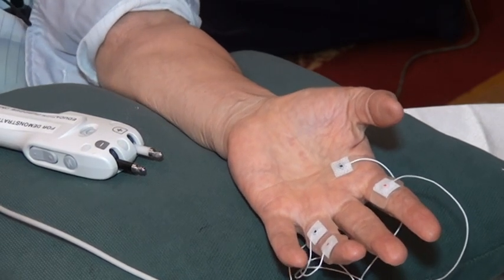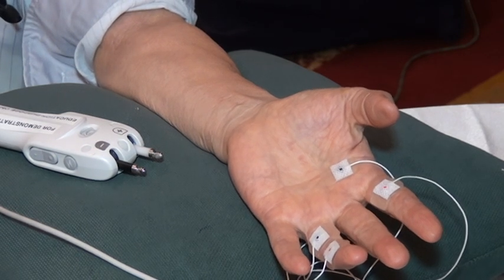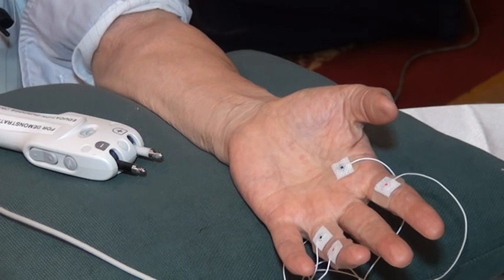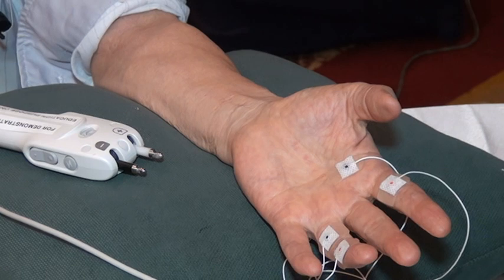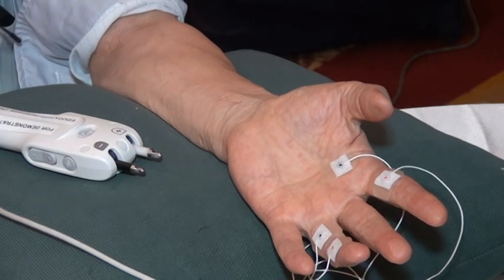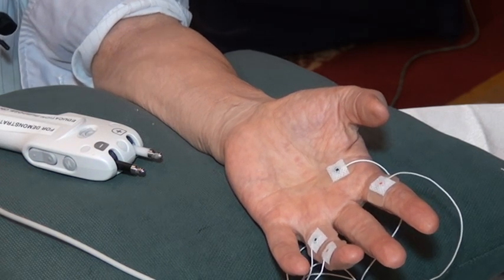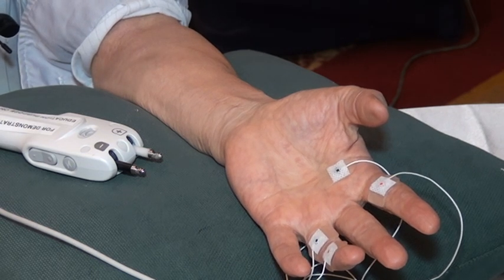Very good. Who said that? Pre. Yeah. So in front of, and then pre what? Pre-motor, right? So this is called the pre-motor potential. That's a name you have to know to ignore it. Don't measure the latency in front of the pre-motor potential. All right? You have to measure it here, ignoring it.